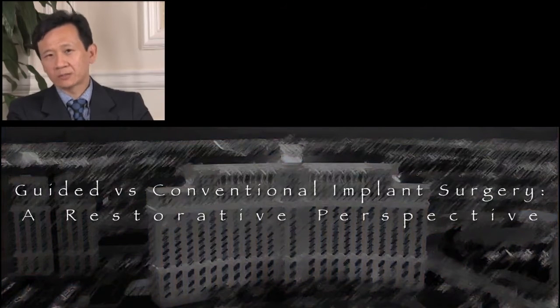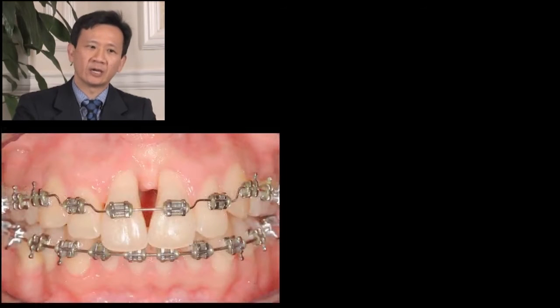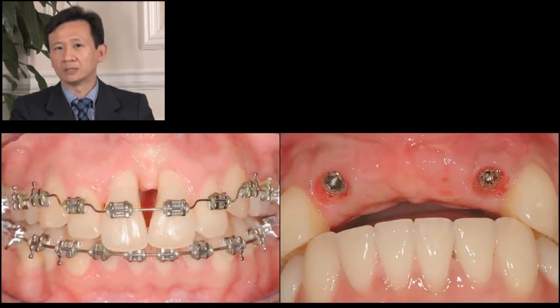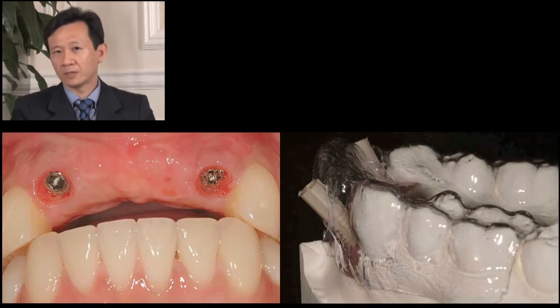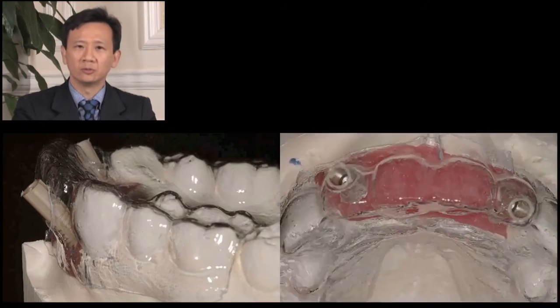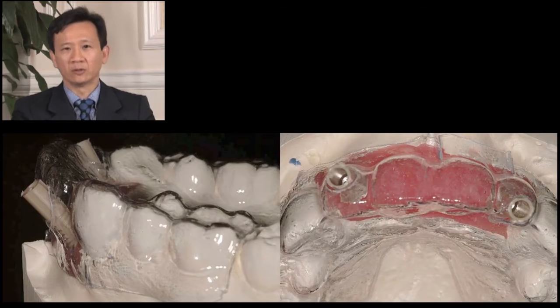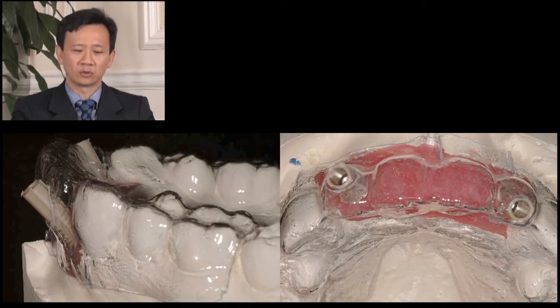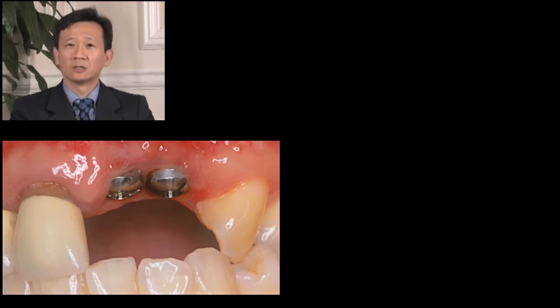When a patient presents for implant treatments, and we refer the patient to have the implants placed, as a restorative dentist, your heart almost drops when we have implants not in the most ideal locations. What do you do? How do you restore patients like this where the long axis is not exactly most appropriate? Or patients like this where two implants are so close?